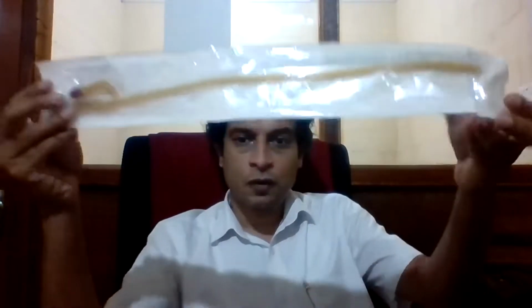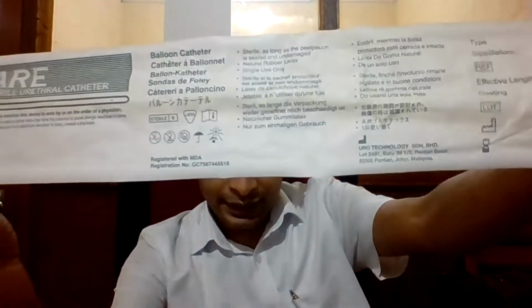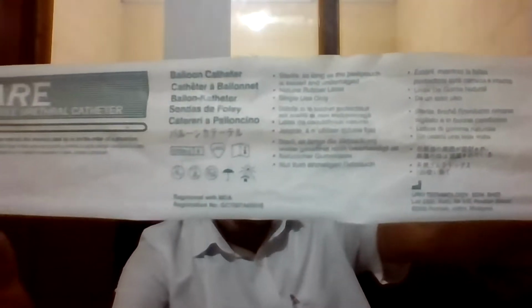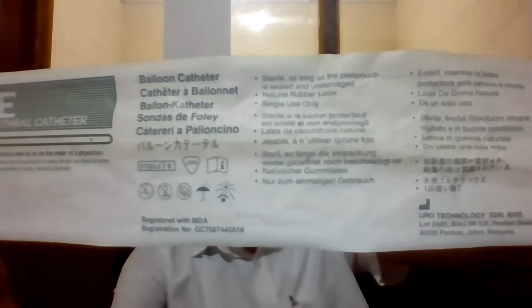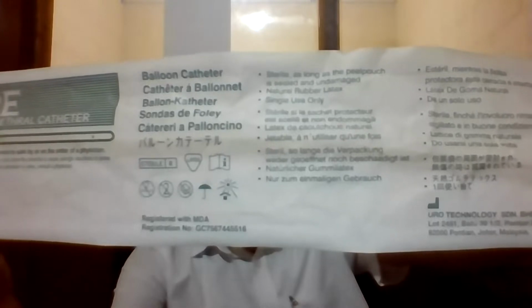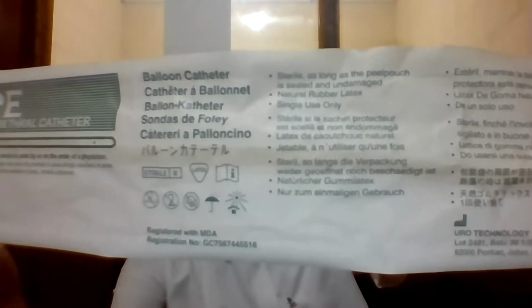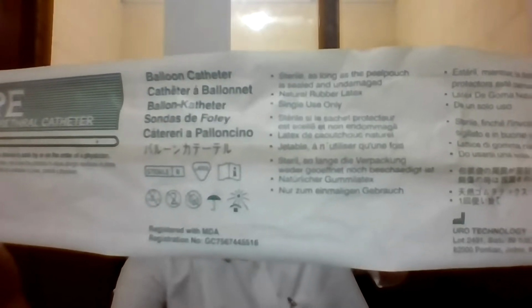Now, I have a Foley's catheter here with me now, right? And I'll just open it up and show you what it's like. Again, all the information is on this side, right? It tells you that it's a catheter. It tells you what the material is. Can you see what it says there? What is the material that it is made of? Anyone? Yeah. What's the material? Latex, sir. Yeah, it's made of rubber latex.